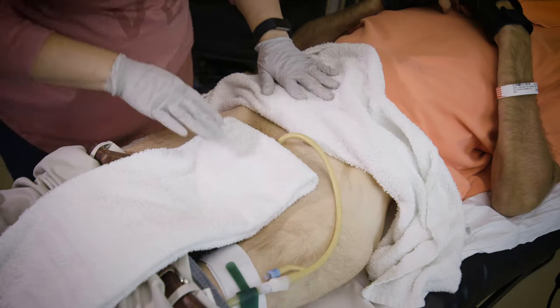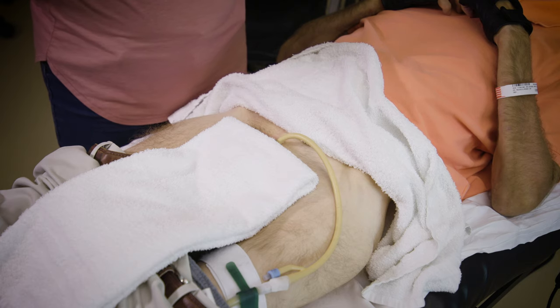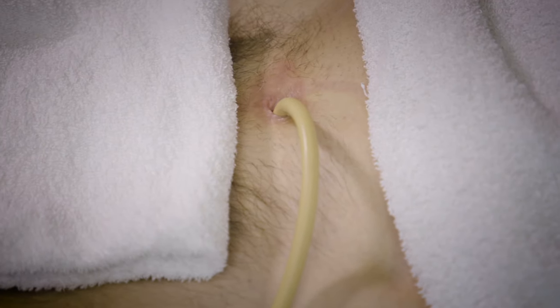To change a suprapubic catheter, it's best to be in the lying position. Typically, most catheter changes are done in bed. Make sure the environment is clean and free from clutter.